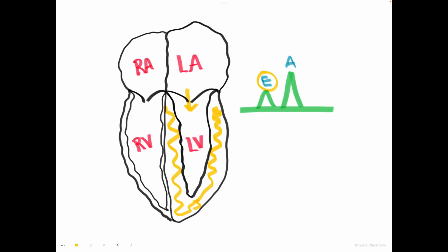So when you have the same amount of blood going into a smaller space, that pressure is going to rise very rapidly in your LV, allowing for less blood to go across that mitral valve before you get to your diastasis, which is why you have that lower velocity here. It's allowing less blood at a lower velocity because your pressure equilibrium or your diastasis is coming a lot faster, which causes your LA to have to contract a lot harder.